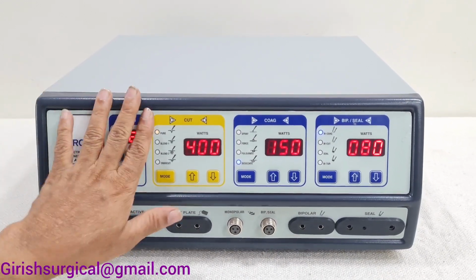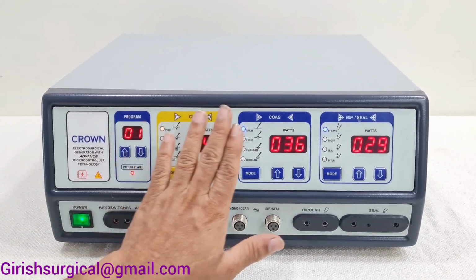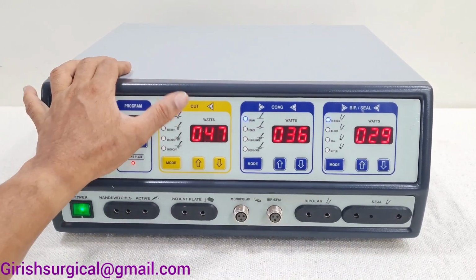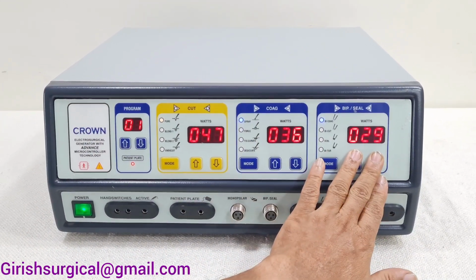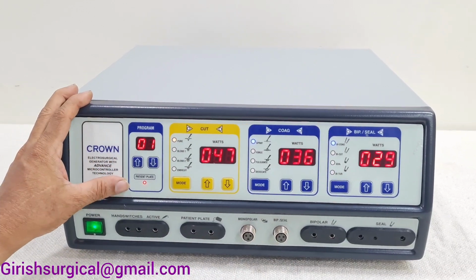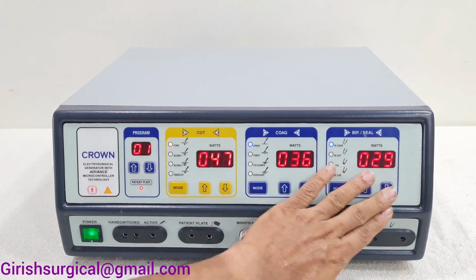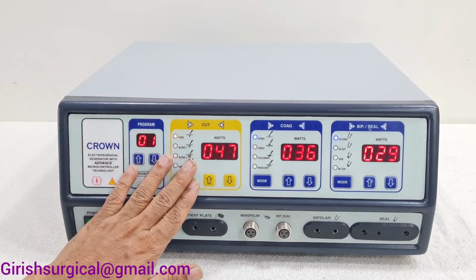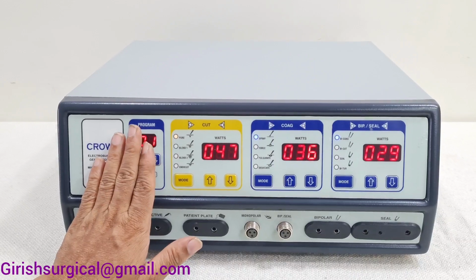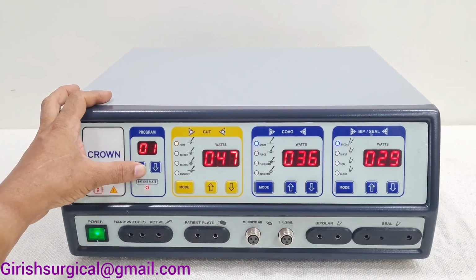So suppose that doctor comes and selects program 1 again. What he had selected as the total output, cutting was 47, coagulation was 36, and bipolar seal was 29. It will be in the memory and automatically it will be set into the machine. The total program will be set automatically.